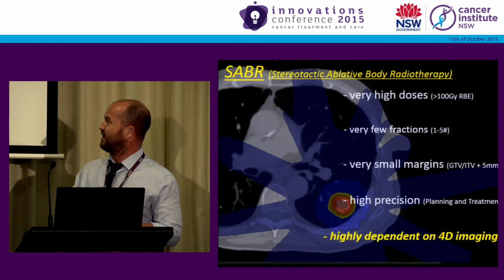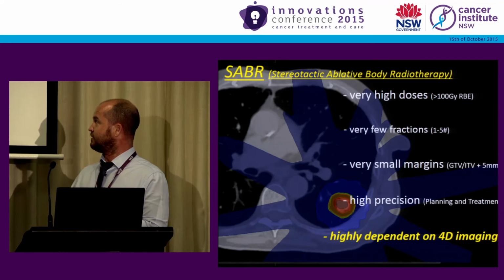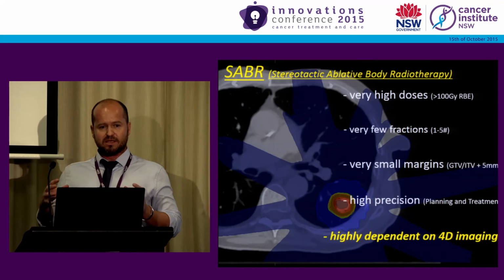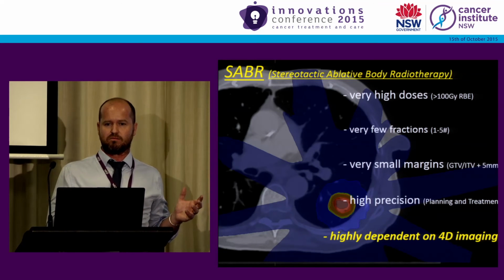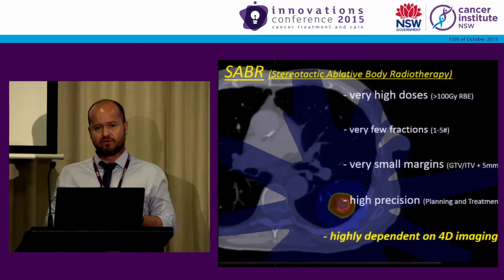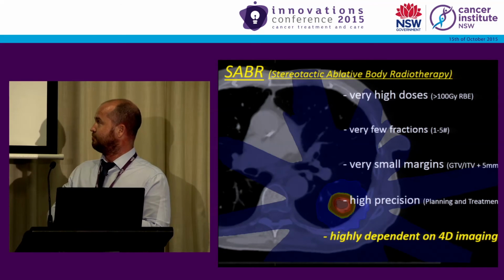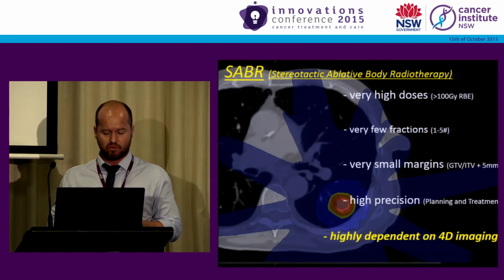So that incorporates about 15-20% of our non-small cell cases that go on to receive radical doses of RT. So just really basically, that's 30 patients in the last 2 years that didn't have to travel away from their home to a major centre, or conversely stay here and receive conventional or a lengthier dose regimen, potentially more expensive, potentially more toxic and less successful. So for this cohort of patients, 4D has been very, very important.